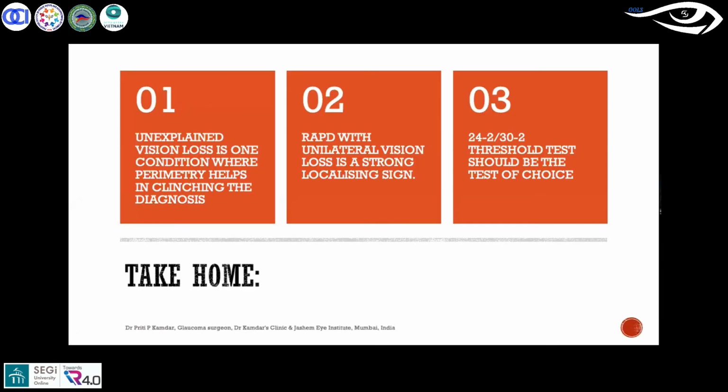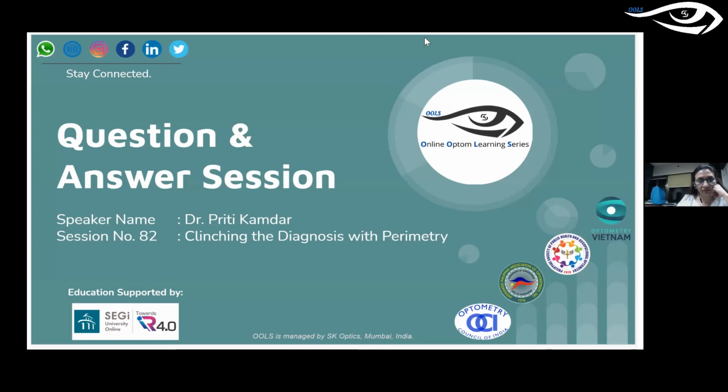Thank you so much, Dr. Priti. I just wanted to get your thoughts on this, because we as primary eye care practitioners are always doing refractions. That's the bread and butter of being optometrists. With that thought, we are also doing preliminary examination. That means pupil examination, just by looking at the pupils. Yes, I can't agree with you more than what you have told, that doing a pupil test does not take much time, but it gives you a lot of information in terms of what's happening beyond the retina.